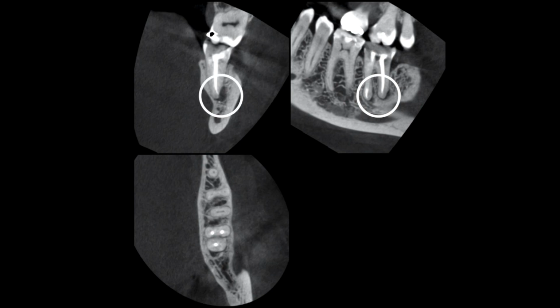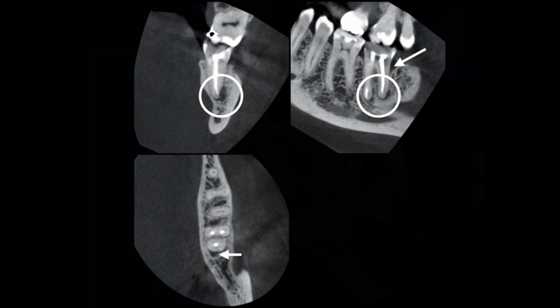In this case you can see the periapical radiolucency quite clearly, and in this individual slice there's also bone loss distal to that distal root of the molar. An indication of bone loss marginally may also highlight the presence of a crack.